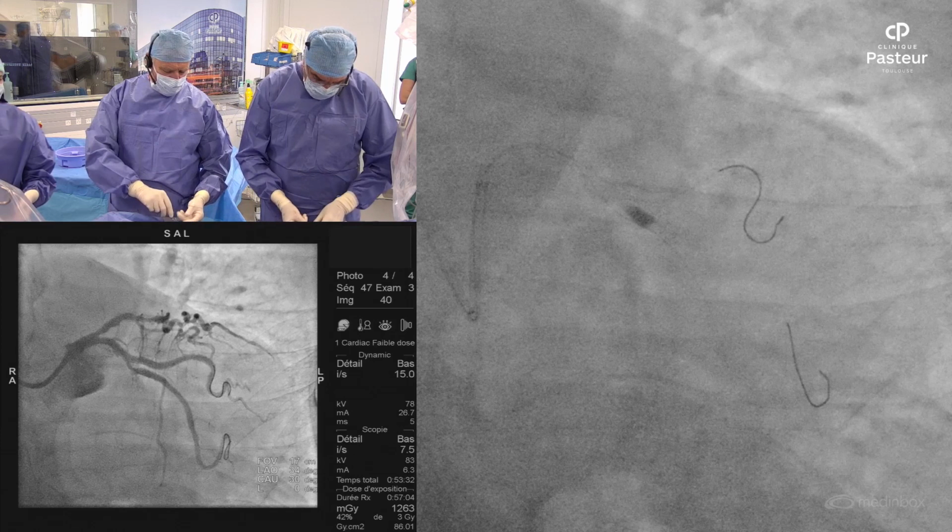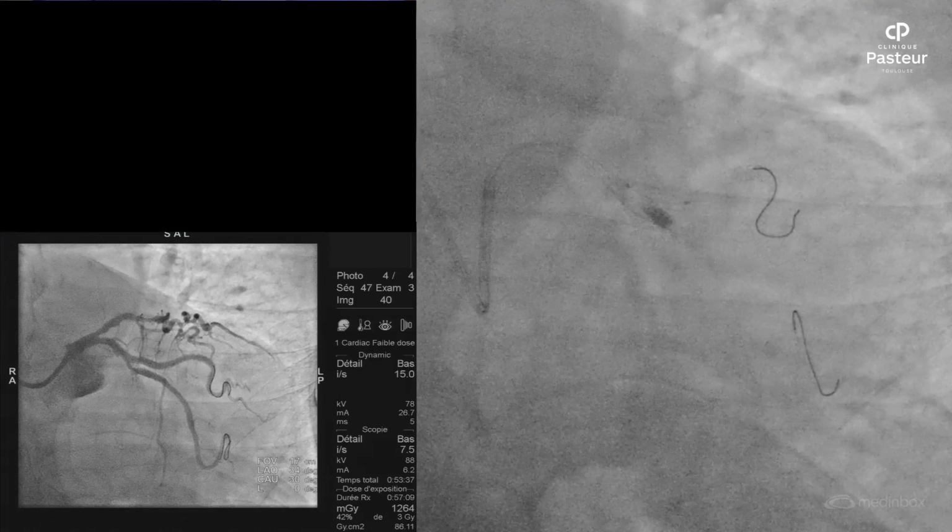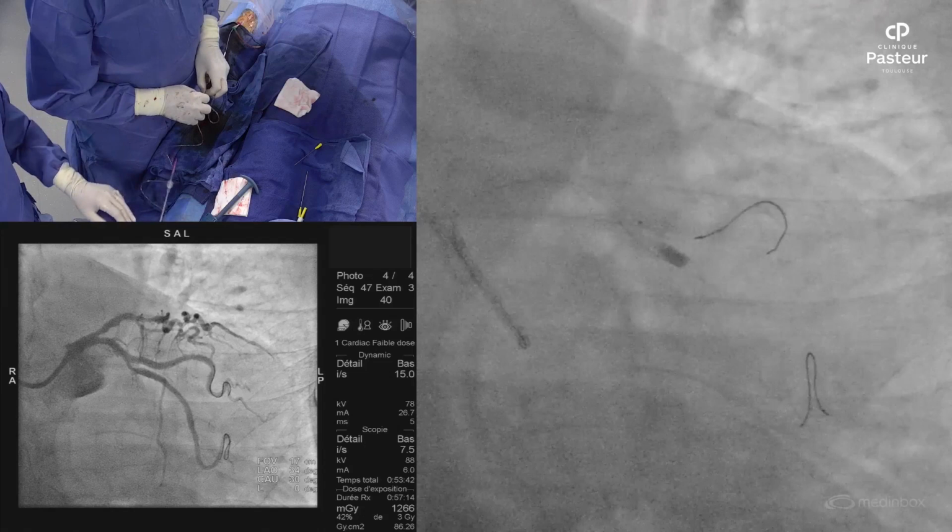But this is life, huh? So we try with a new balloon, negative. I hope that we could see the difference when you have a new device. It's better. Well, it's not perfect, but thicker. Anyway, maybe it's the wire. Yeah.